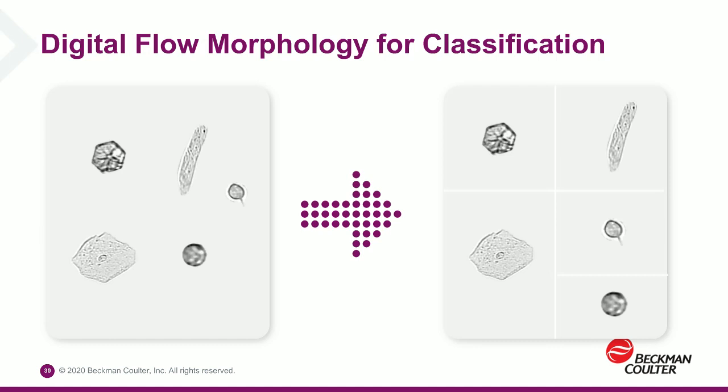The system takes that image and automatically isolates, frames, identifies, and characterizes each of those urine particles present into one of 12 primary classification categories. The system then further allows the technologist to continue and subclassify them into one of 27 additional subcategories.